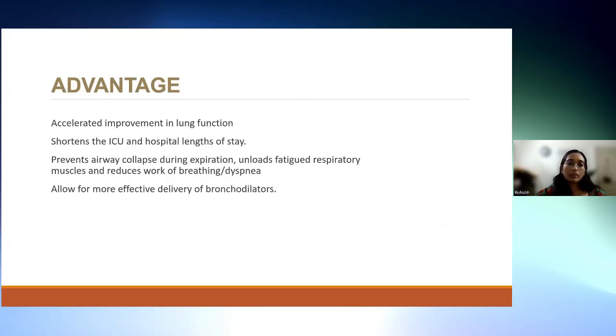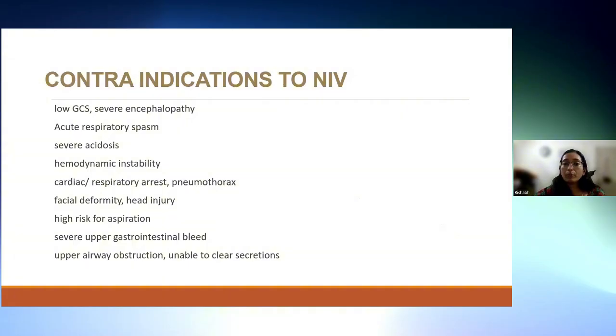The advantage is that it improves lung function. There can be a shorter ICU stay. It can prevent the need for intubation. It can prevent airway collapse, lower respiratory muscle fatigue, and reduce the work of breathing. And obviously, more effective delivery of bronchodilators.